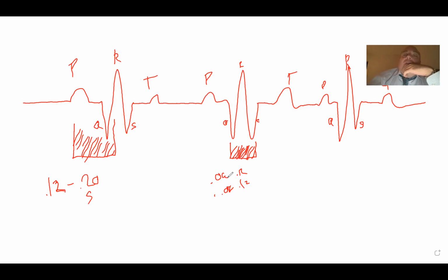Next, we're going to look at the QT, Q to the T interval, okay? So why does the QT interval matter, all right? Well, let's back up. What is the QT interval, okay? The QT interval is the time it takes for the ventricles to depolarize and then the ventricles to repolarize again, okay? So why does that matter?